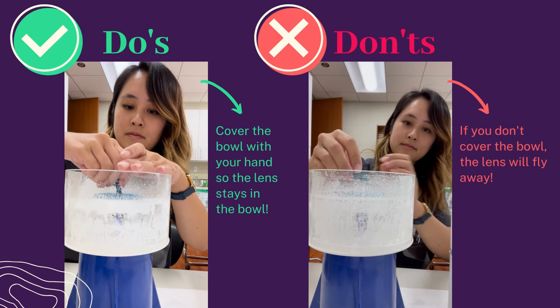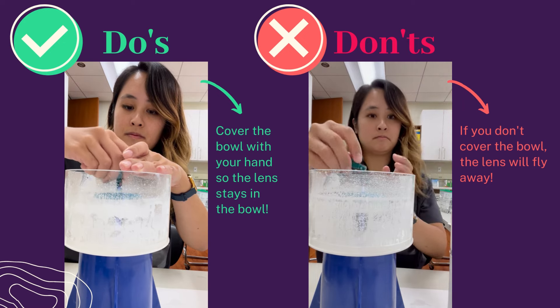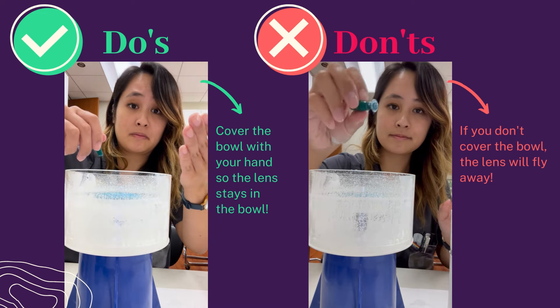A quick tip: suction onto the lens tightly — unlike what I did on the right — and cover the bowl with your other hand, so when the lens decides to fly away, it stays in the bowl.